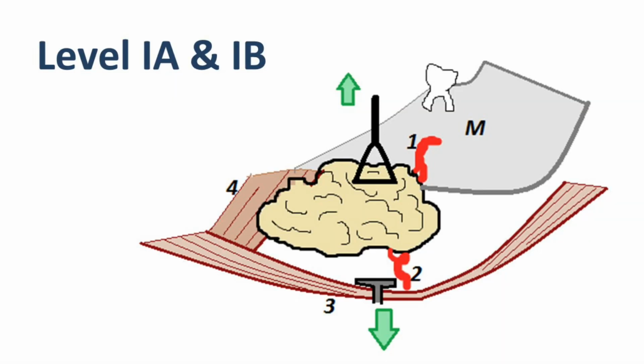The final step is to perform level 1 dissection together with the submandibular gland. The facial vein running over the gland is divided and the fascia overlying the gland, which contains the marginal mandibular branch of the facial nerve, is swept off of the gland superiorly. The tendon of the digastric muscle is retracted inferiorly while maintaining upward traction on the gland to deliver the facial artery passing deep to the digastric muscle and the gland.